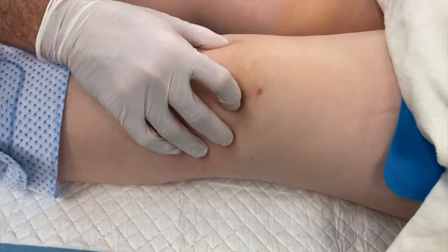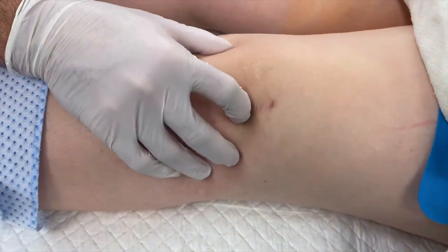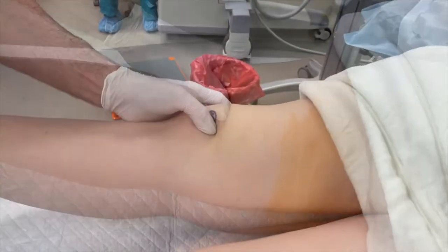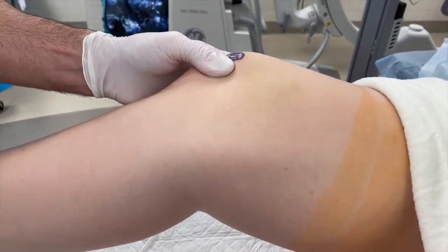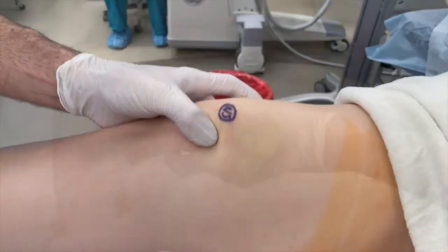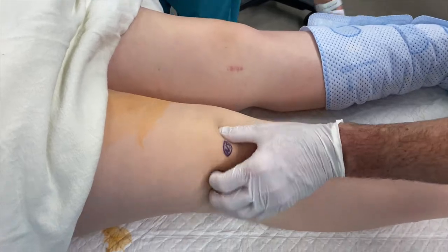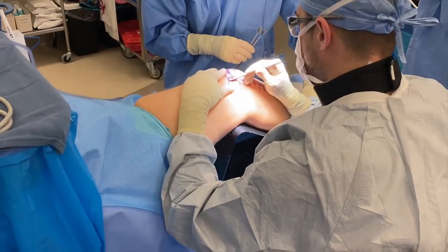Here we're looking at that completed left knee, and you can see how nice and stable that patella is compared to the right knee, where we're able to dislocate the patella even at 30 to 45 degrees of flexion — it's quite unstable. So we're going to go ahead and perform the same procedure on her right knee now.